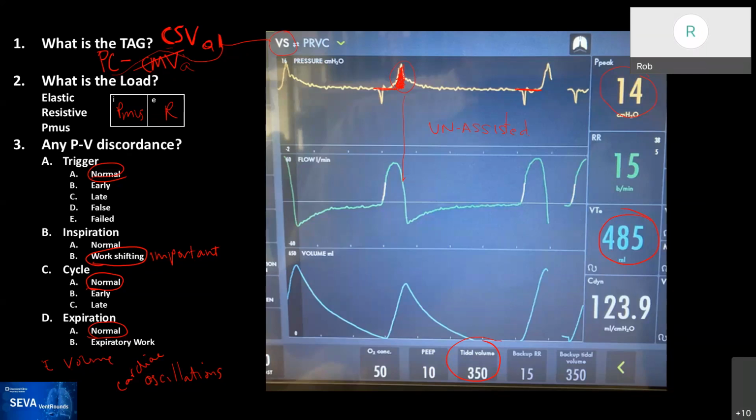There's the paper that you just mentioned, from Magdi Yunus. Thank you. Yeah, it's on the chat for all of those that are interested, but that's exactly what's happening. So it's just an artifact, and it's not pressure that you're delivering to the respiratory system to aid the patient. All right. Really good. So an unassisted breath. You can imagine that if I'm walking by this patient, you would say extubate. He's getting appropriate tidal volume with no support, and an appropriate respiratory rate on his own, unless they don't have brain status or whatever.